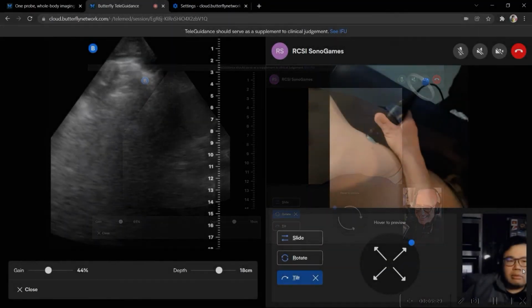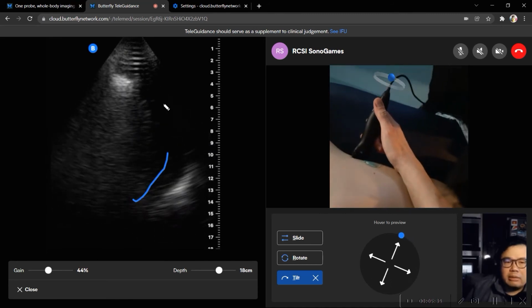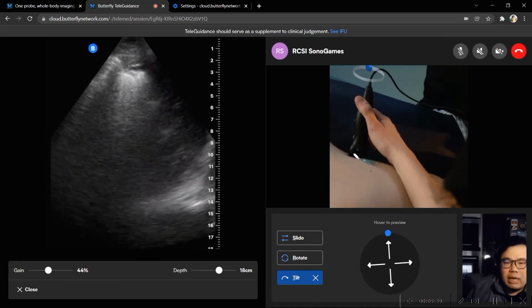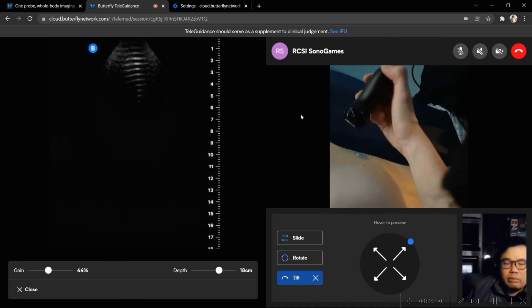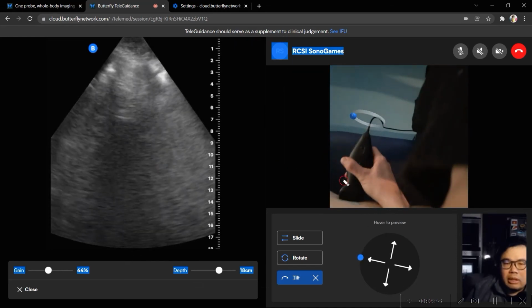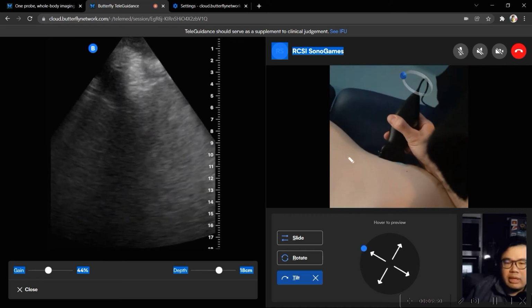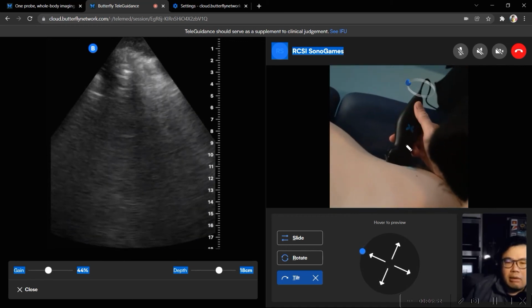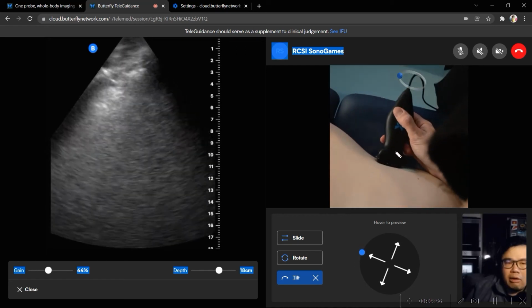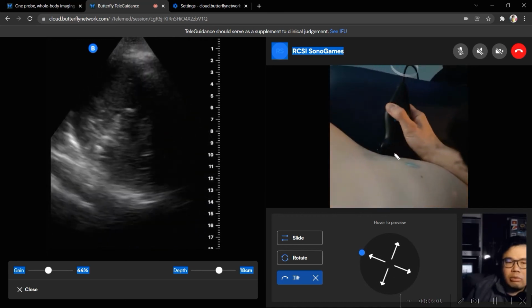Another shot. So make sure the probe marker is, you need to flip the probe again. So this is your diaphragm. Your diaphragm is appearing on this side. So I think your probe marker needs to face towards the patient's head, which is in this direction, towards Thomas's head. Got it now. What you need to do is bring your hand almost to the bed. So you need to go quite posterior. Slide the whole probe. Yeah, there you go.